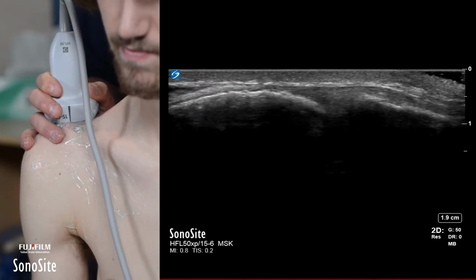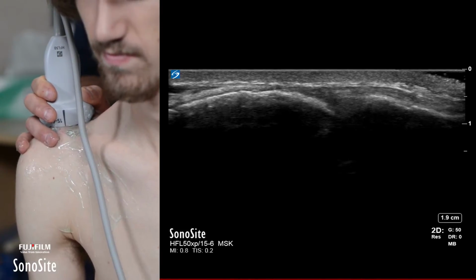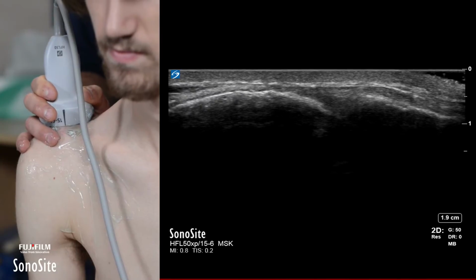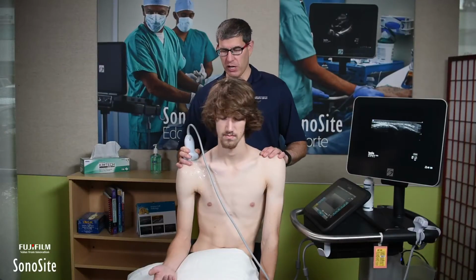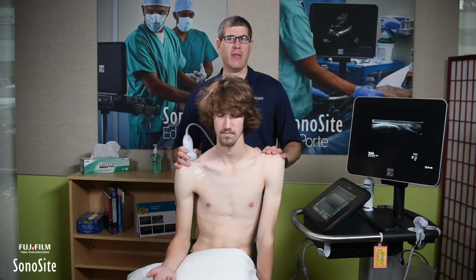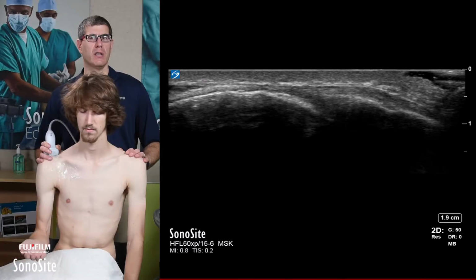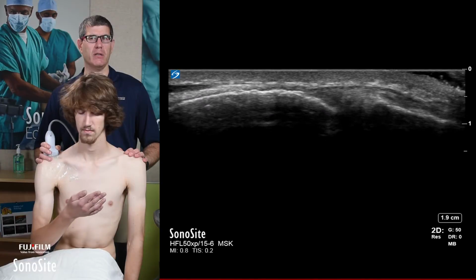Sometimes in patients who have osteoarthritis, you may be looking for things like cortical irregularity, some cystic changes, you may see some bubbling over, you may see some stuff floating around in the synovial fluid. One of the things that we'll do is a little bit of a dynamic test. I'm going to be pulling the cord over behind his back so the cord doesn't get in his way. And then, Jacob, if you would be kind enough to slowly put your right hand on your left shoulder. I'm just looking for abnormal motion patterns, particularly a lot of abnormal narrowing.